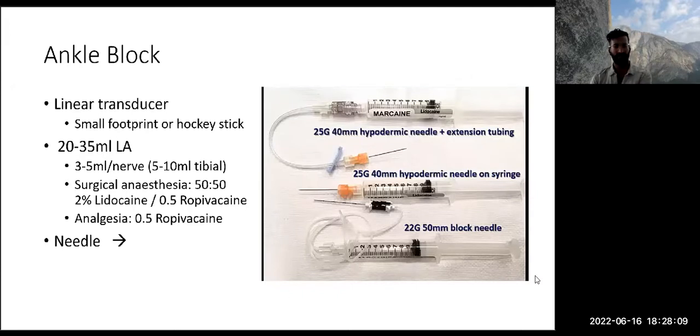The utility of using a sharp needle in this case is that there's often some thicker fascial layers. They're all very superficial, and it can be actually quite challenging to get a blunt needle into these areas, and it can be more painful for the patient. A sharp needle mitigates some of those problems, but this certainly adds an extra risk, as contacting a nerve with a sharp needle is much less desirable than contacting it with a blunt needle. So you have to be able to manage that risk well.